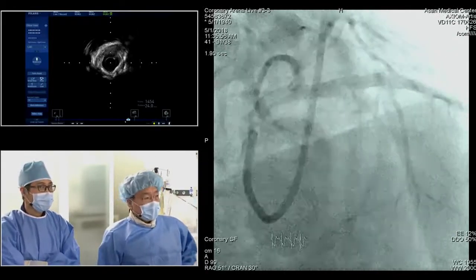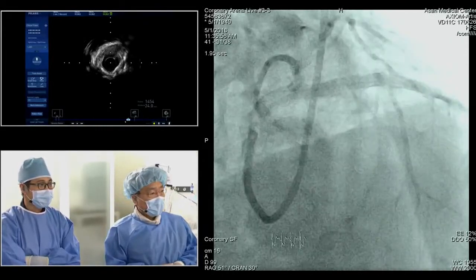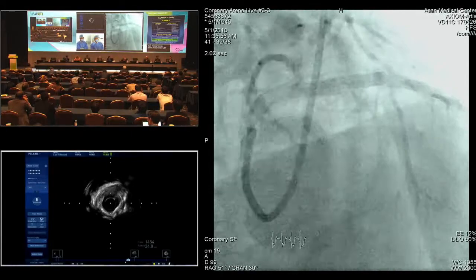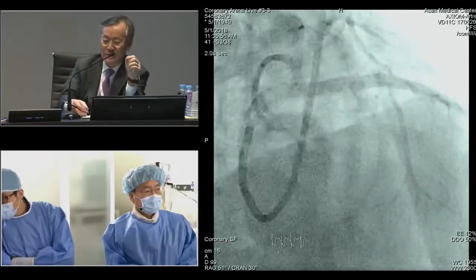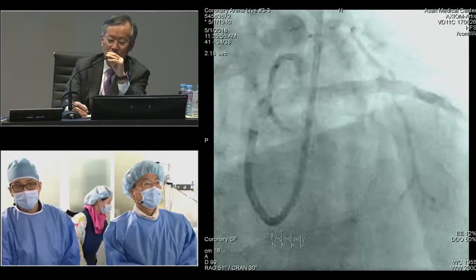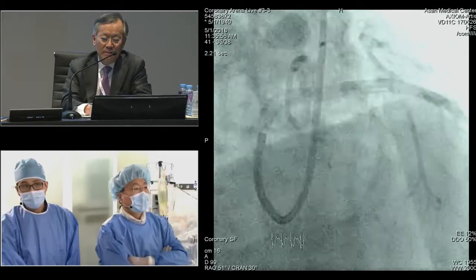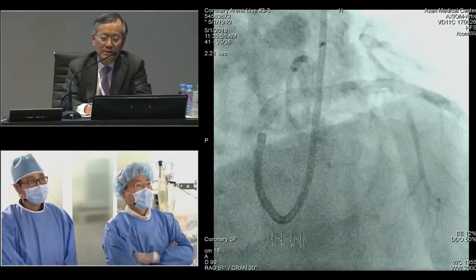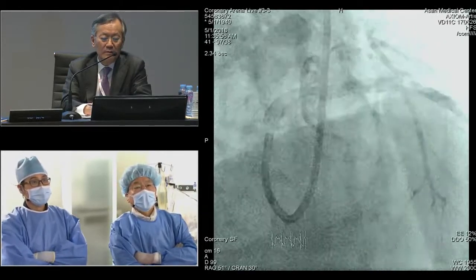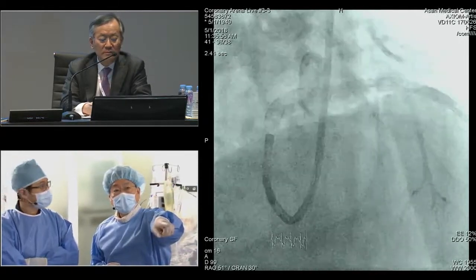SJ, do you hear us? Yes, of course. Yeah, there was a question of the diagonal, and also there was a question of OCT. I thought I saw pretty tight stenosis in the diagonal. And what's your plan? Are you going to go after the diagonal now, or can you show us the diagnostic setup shots? All right. Show us again. Would you show us the diagnostic angio first?